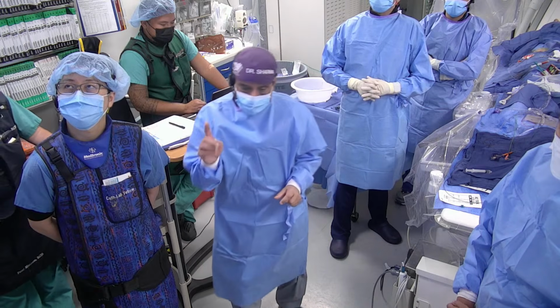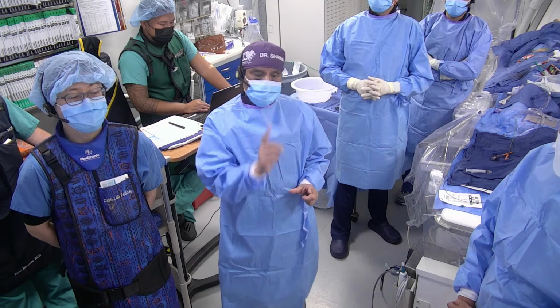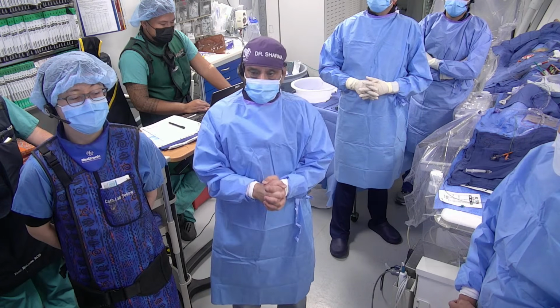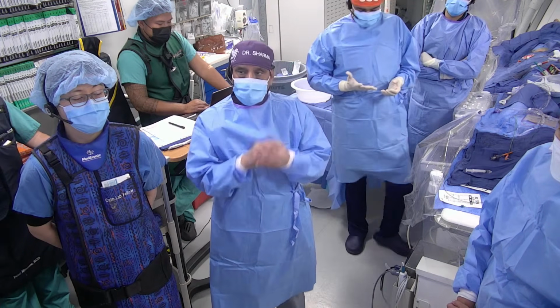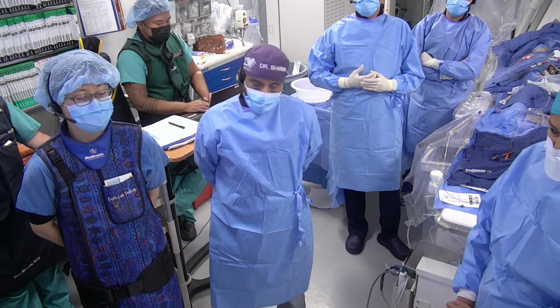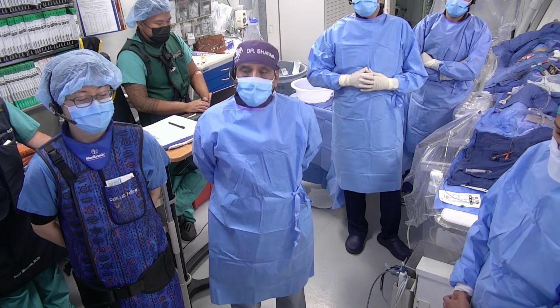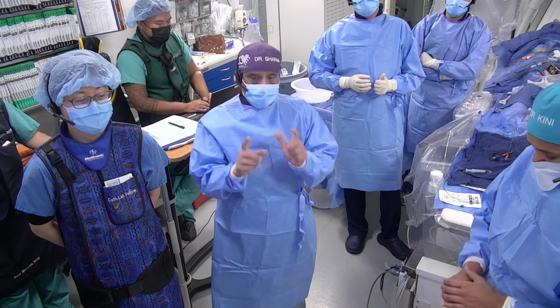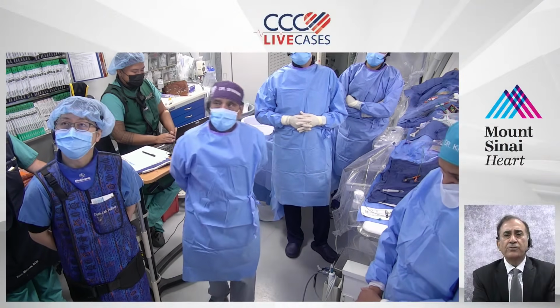The point is very important. Every trial has shown that once you put in two stents, or the provisional stent approach has a bad outcome compared to your single stent approach. So the key is that anytime you do a bailout, a second stent is not good. So I always say the controversy of two stents versus one stent is not whether you can put in two stents or not. You need to identify the lesions which are going to need two stents and go with the two stent approach proactively. Excellent.